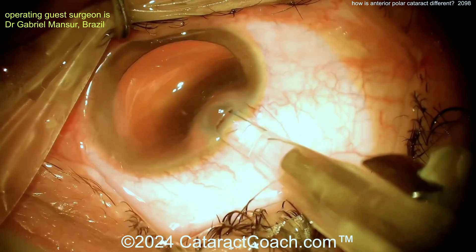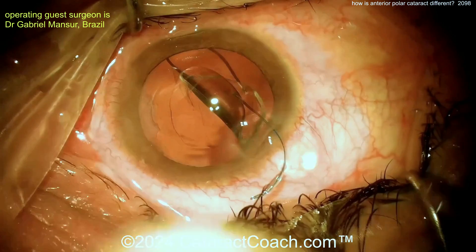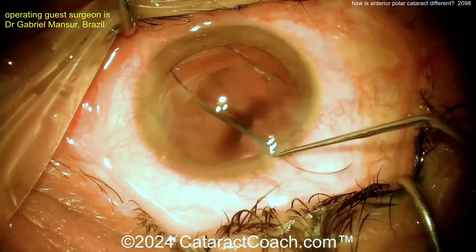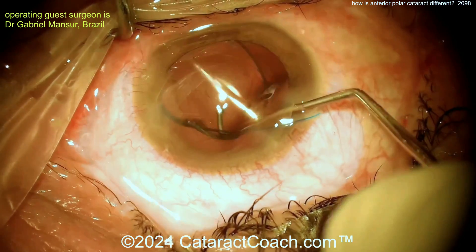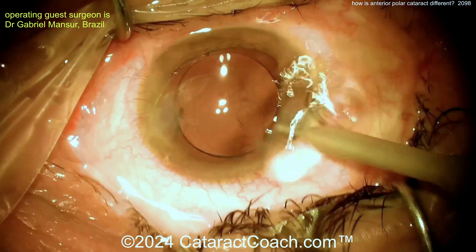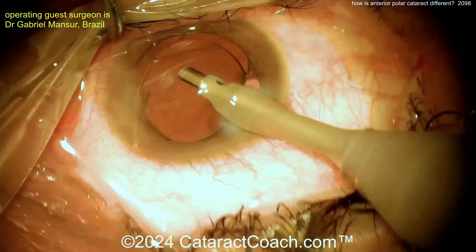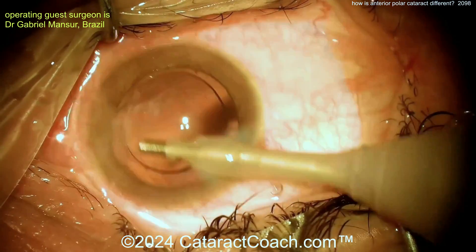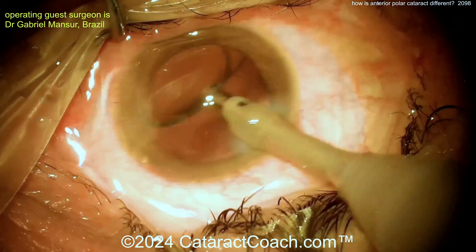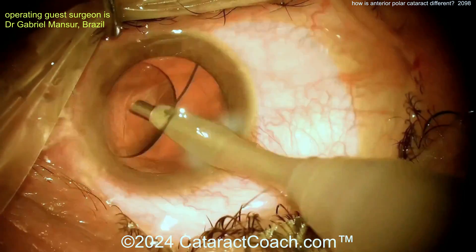Now delivering the lens — here comes the lens in the capsular bag, nice and easy. Looks like a three-piece lens. It's flipping over the wrong way — you don't want that. Good save — beautifully done. The lens is going totally in the capsular bag. Fantastic technique. Now taking out the remainder of the viscoelastic. No use of the I&A probe at all — not needed. Be careful going under that lens with the phaco probe, but getting that viscoelastic removed pretty easily.